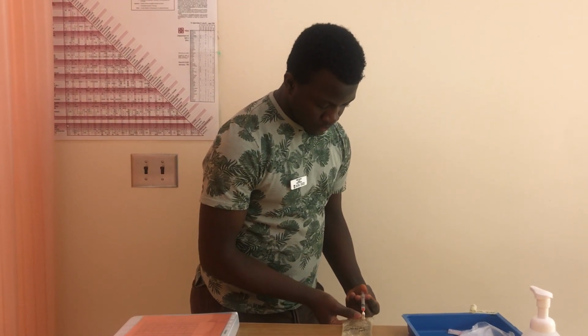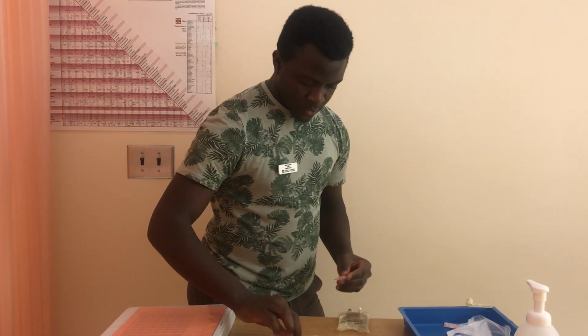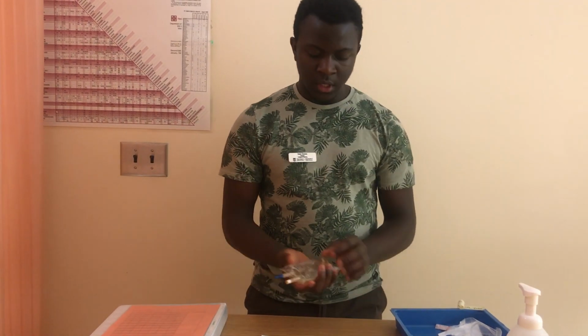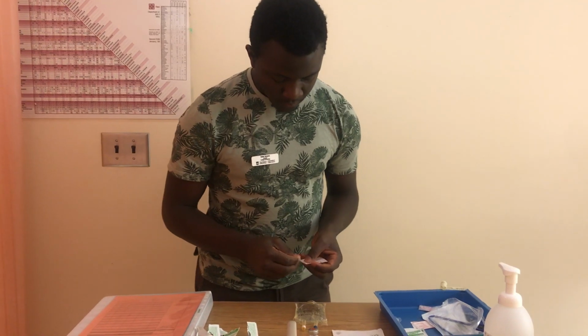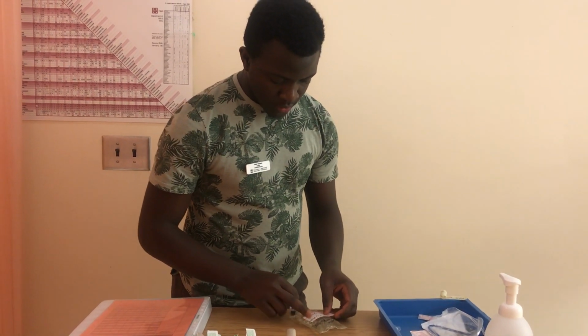I'm going to do my second check further. So my patient's Emma, hydrocortisone is the medication. So I have hydrocortisone and the dose is 150 milligrams. And once that is injected, I'll just put this in the sharps. And now I gently roll this to make sure the medication is well mixed. And I'll just put my label on it. The route is IV, and this is an IV vial, and this will be given IV.